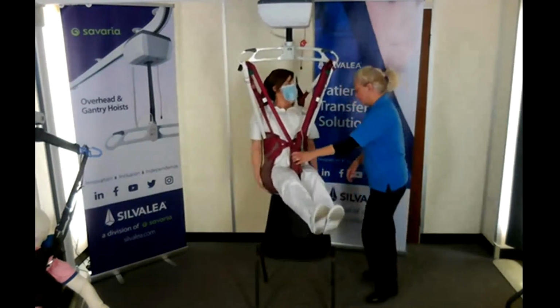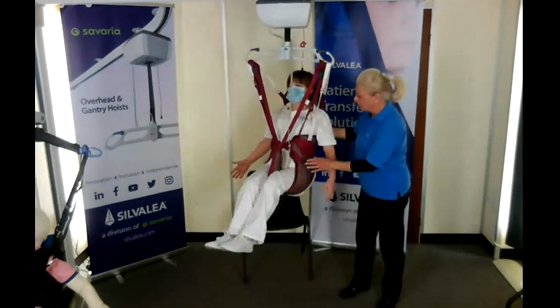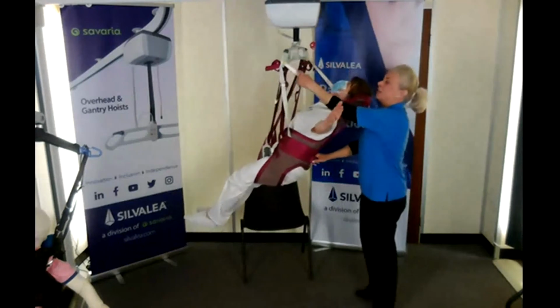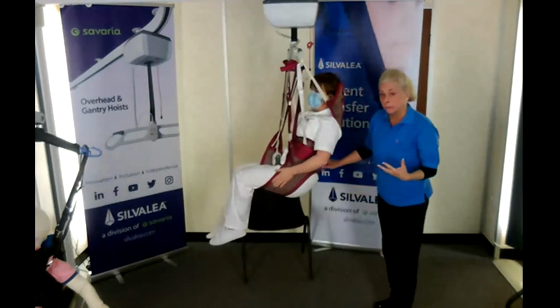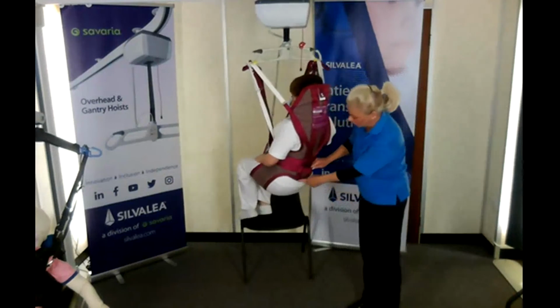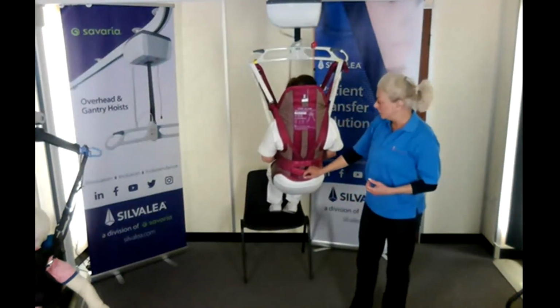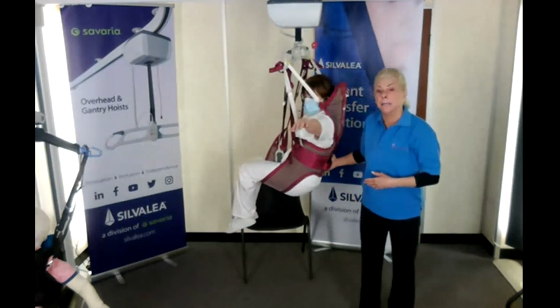Oh, Julie's off. She's doing her active wriggly bit already. So we can picture that, if you've got an extender, then this counterbalance flows through, is on top, and allows the movement that will keep someone contained safely for your transfer. It has got a good aperture there for hygiene transfers, so that is possible. It wraps around, as I said, it's going to fit very firmly.